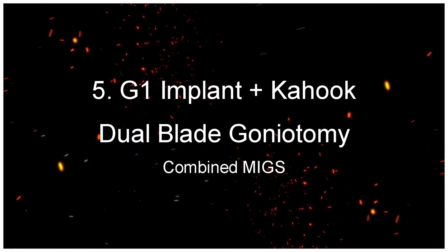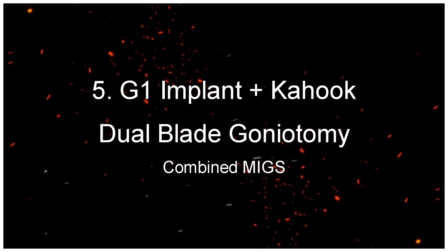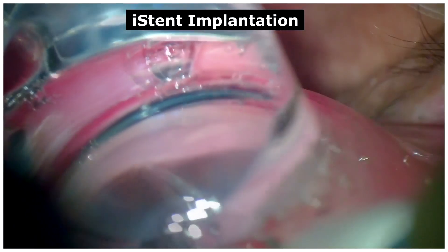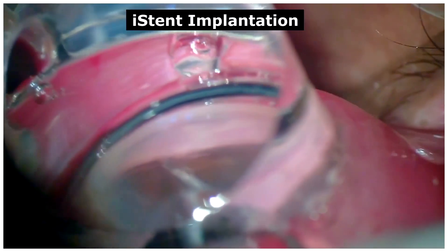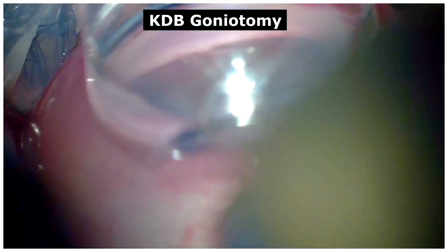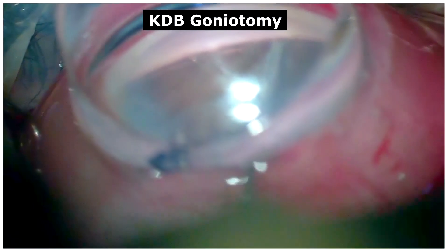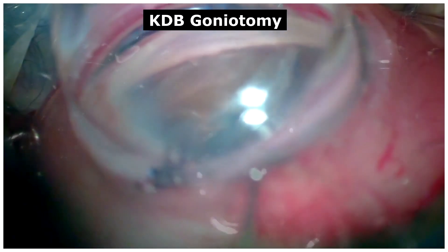G1 Implant Plus Kahook Dual Blade Goniotomy — The Combined MIGS. Here we have a case of a G1 iStent implantation which was successfully implanted into the trabecular meshwork. Following which, an additional MIGS procedure was performed — the Kahook Dual Blade Goniotomy — on either side of the implantation, at least one to two clock hours apart, to increase outflow via the trabecular meshwork.